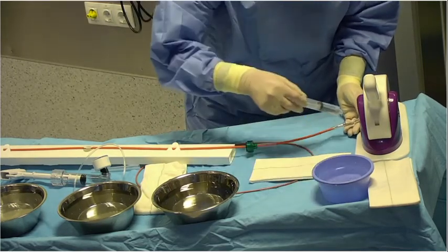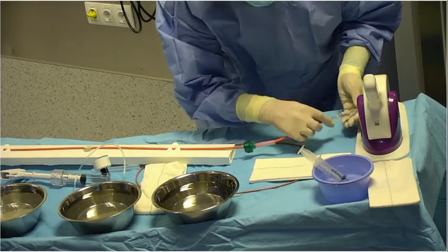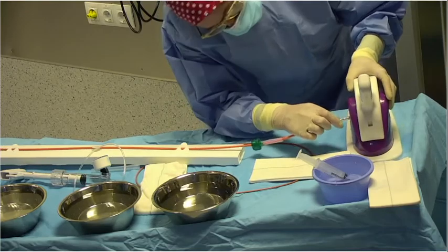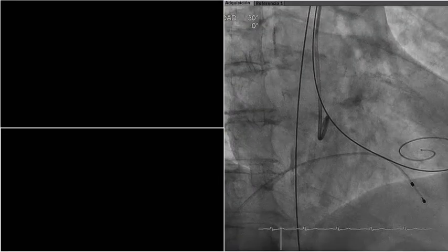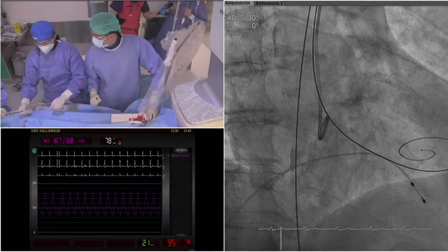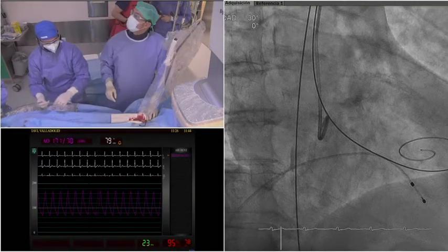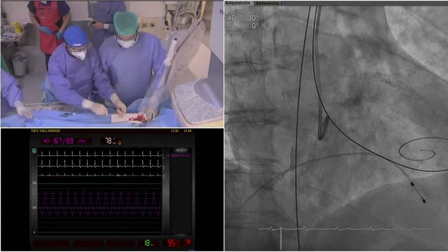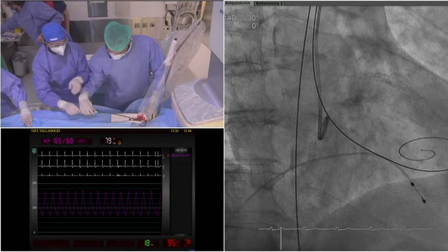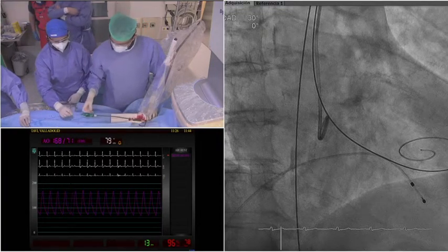We are still watching the valve crimping. Let's see the table now, please. No, let me have the dilator. Do you want the dilator? No, I meant dilating the introducer, as we always do. Okay, let's go in, come on. So you can see me right now. Okay. So you can see very well the Python, I think.